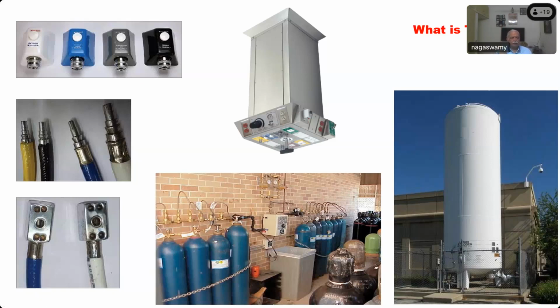No, sir, because we need to test whether it comes off easily or not. You have to press the outer circular portion, hold it, rotate it anti-clockwise, and then pull it out.